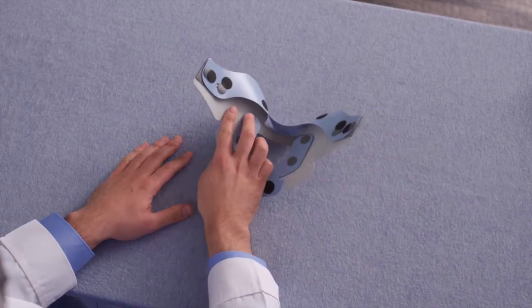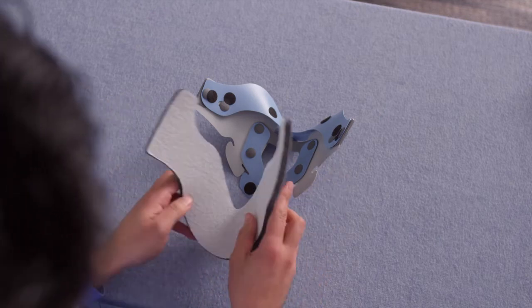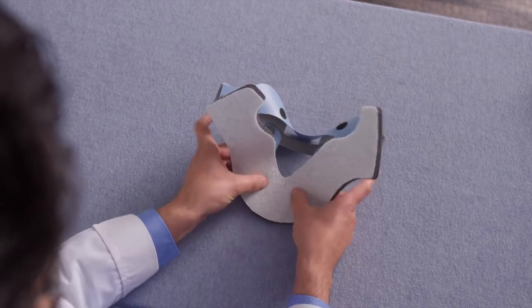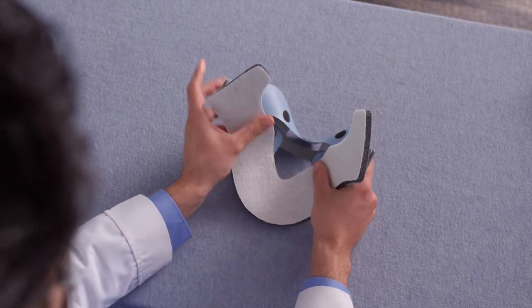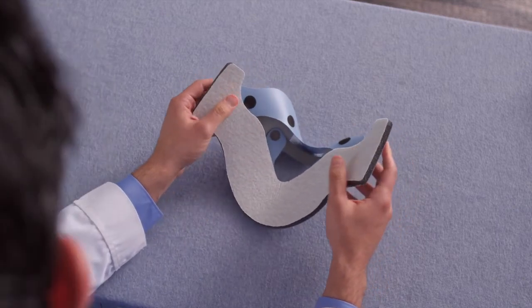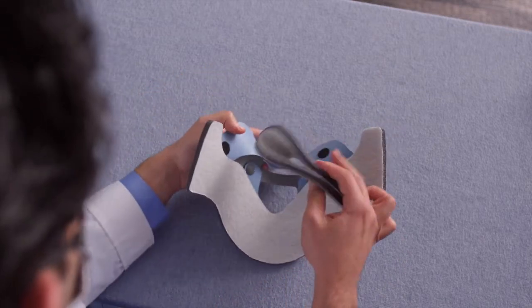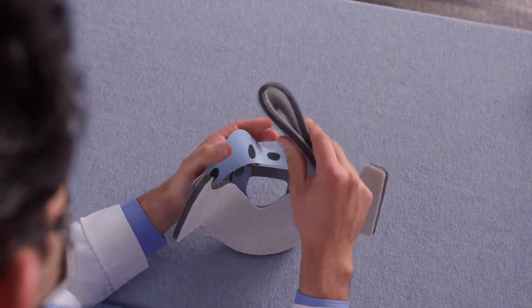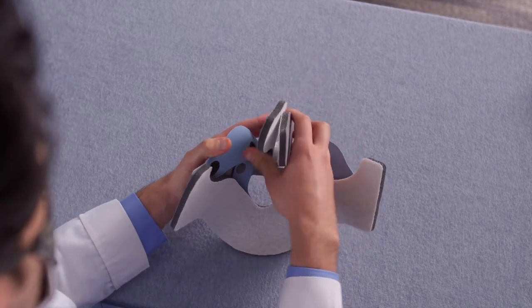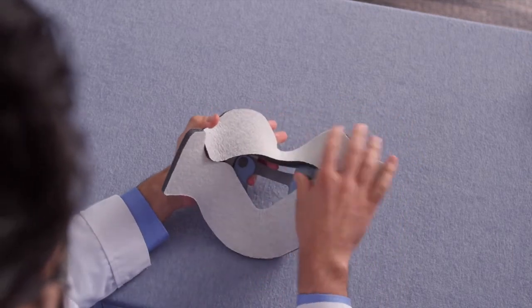Next, reattach the pads to the anterior panel assembly, starting with the chest pad. Again, use the window to center the pad on the collar assembly. You want the bottom curve of the pad to align with the bottom edge of the window cutout on the anterior collar assembly. Finally, replace the chin pad onto the anterior plate, centering it against the plate and reengaging the hook dots onto the loop material of the pad.